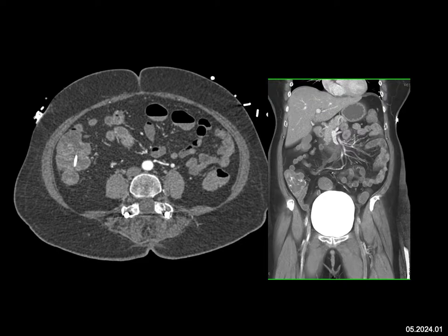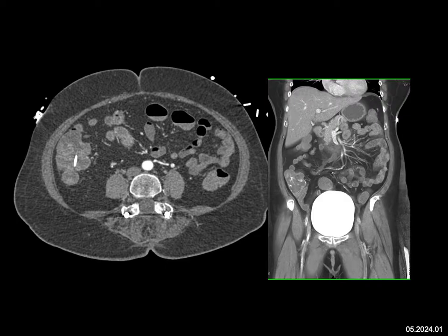When I look at the cecum, I see a clip, which means the patient had a polyp and the polyp was removed. When you look carefully at the axial views and the volume rendered views, in addition to the clip, you see other high-density zones — this was bleeding in the cecum following polyp removal, one of the complications that usually goes away on its own without any intervention. We told the referring clinician, the patient was admitted, and did fine.